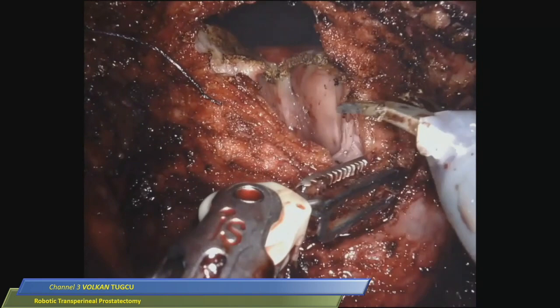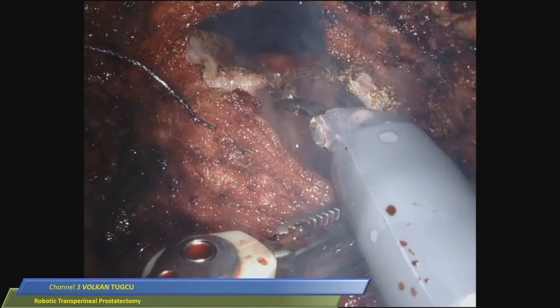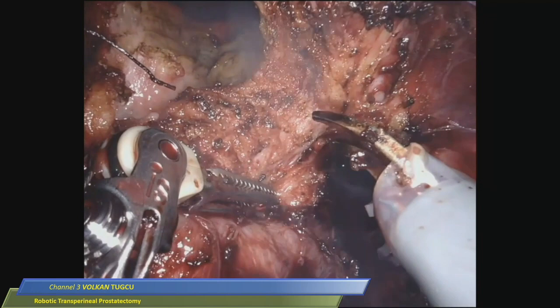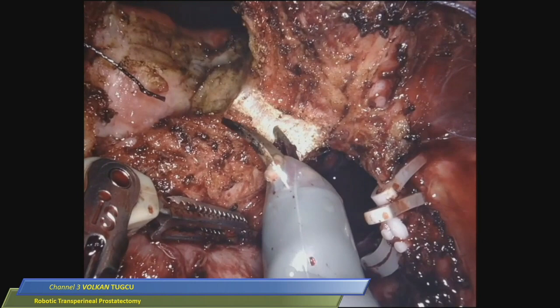Have you tried to put a catheter if you have doubt with the ureters, if you cannot find the ureteral meatus? With 30 down, we insert the optic. We always see. Really. Okay.